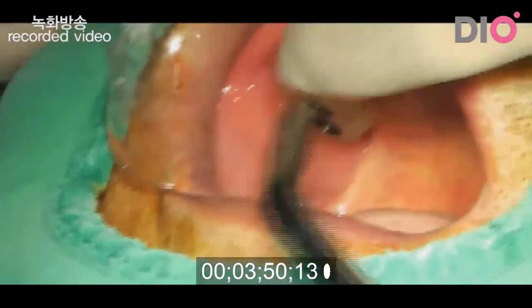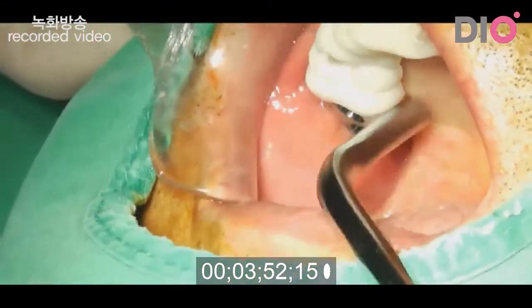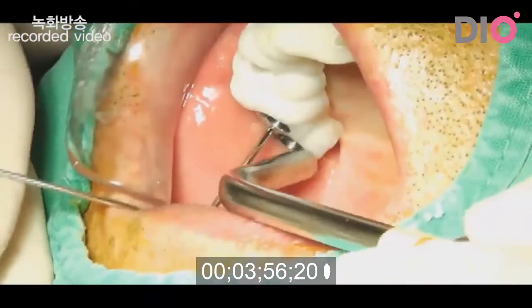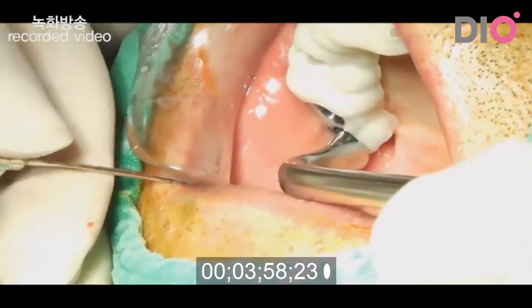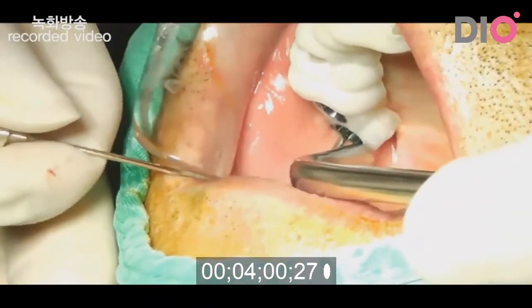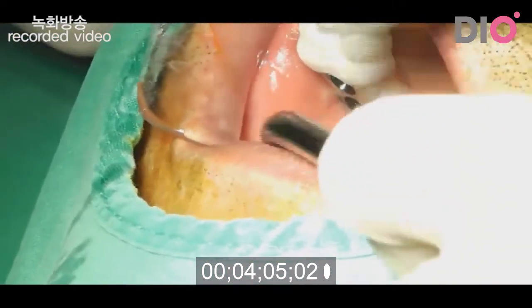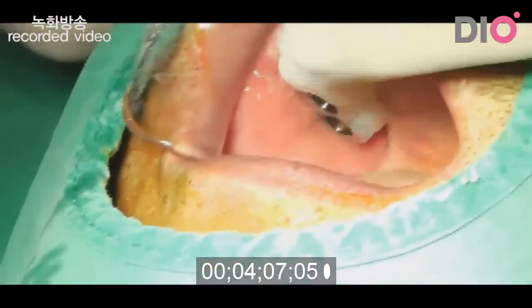Okay, I drilled using 2.0 drills. And in between, I irrigate into the certain site with saline. And then, this is 2.6.